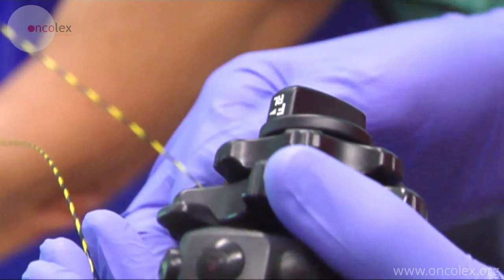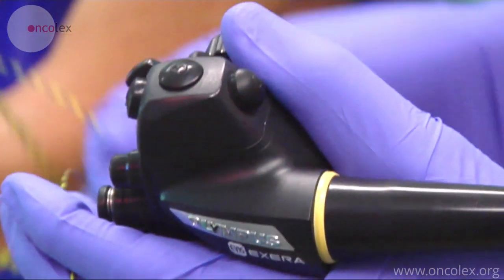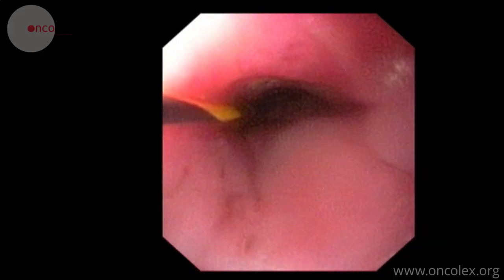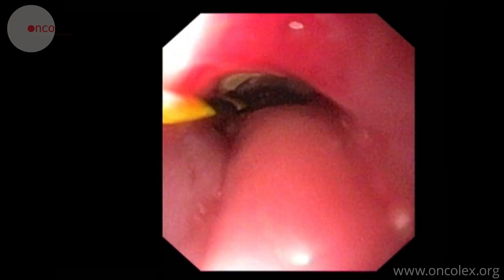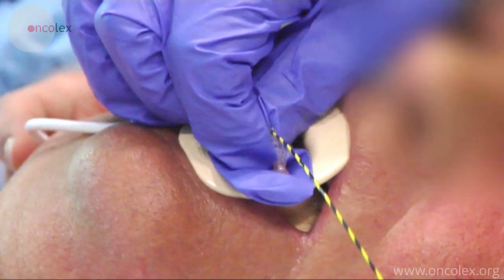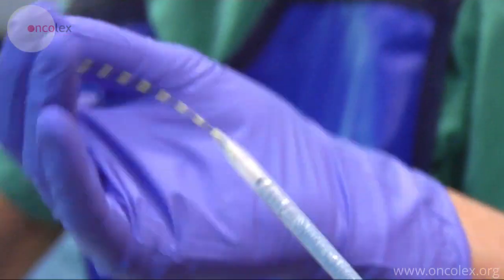The stent can now be placed. A guide wire is first placed through a canal in the gastroscope. The scope is then removed and the catheter with the self-expanding stent is moved down over the guide wire.